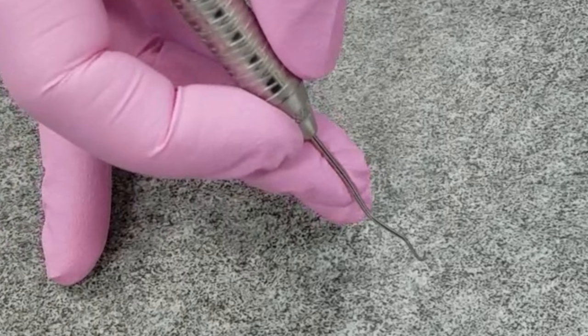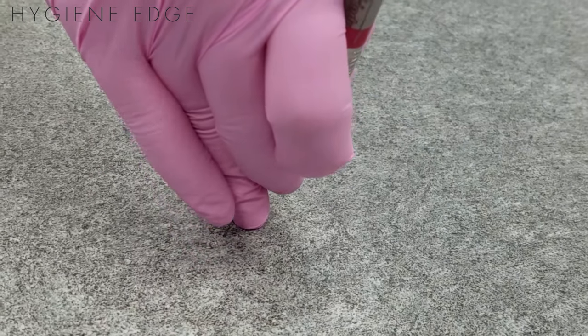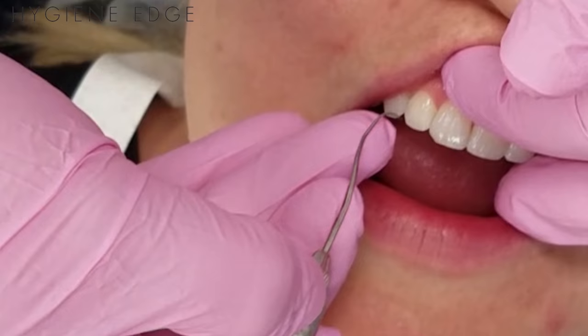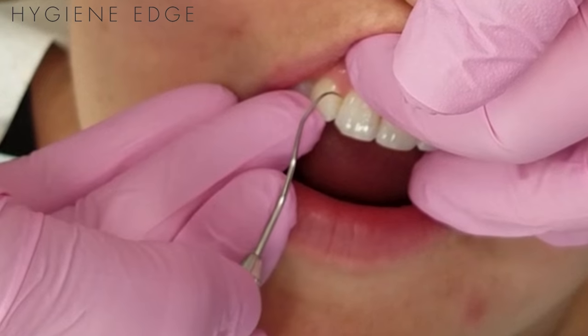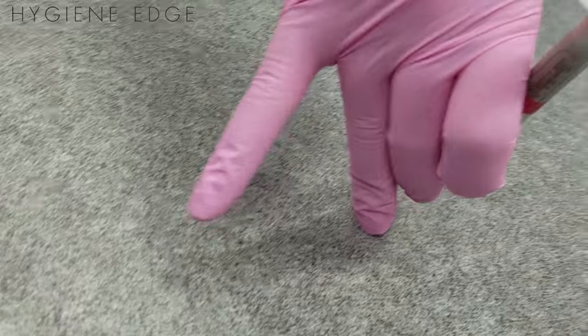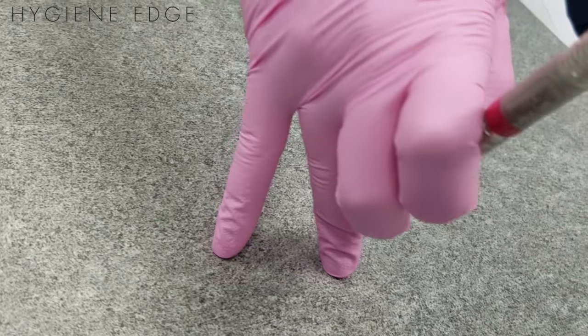The side of the middle finger pad will rest slightly on the instrument shank. The fingertip of the ring finger is your fulcrum finger — it will rest on the teeth for support of the hand, wrist, and instrument. The middle finger and ring finger can never be separated; they must always remain together for support.